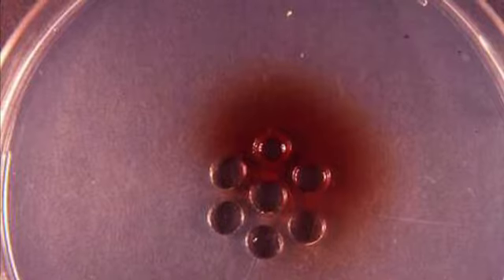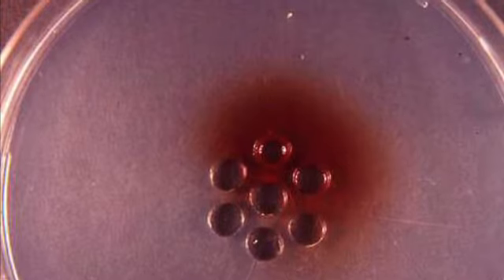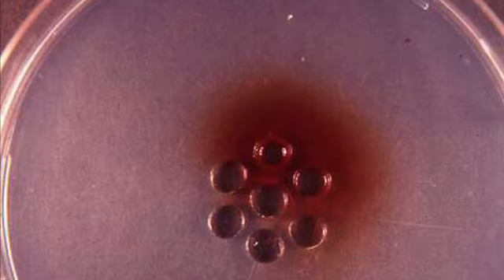The elk blood will develop. So this gives you the opportunity to test multiple samples at once and to test against various animals. I've used this dozens and dozens of times, and I really like it.